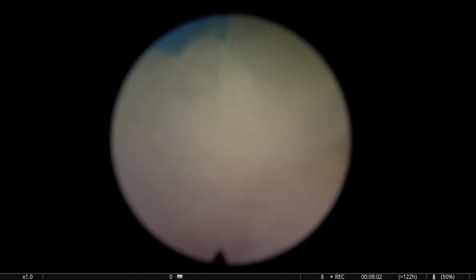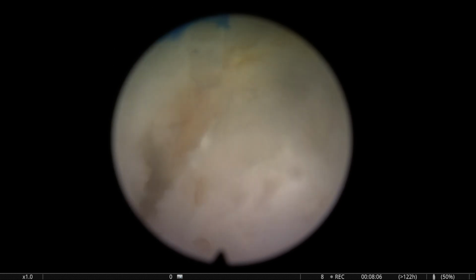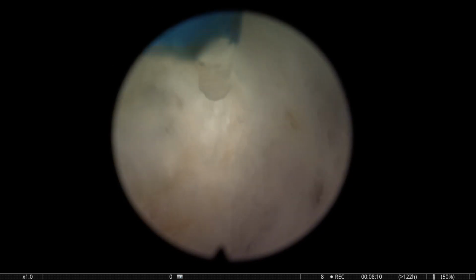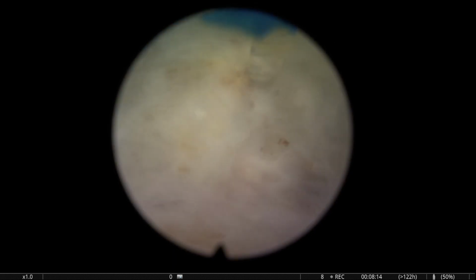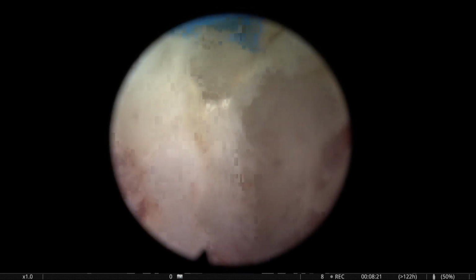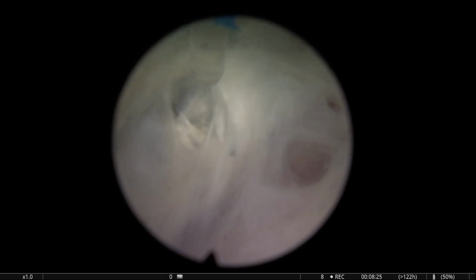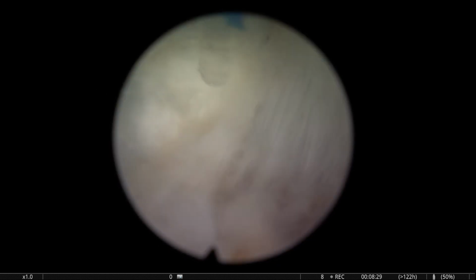But you see, there's more tissue there. There you can see there's a nodule. So it was a little bit tricky. Of course, these prostates have already undergone surgery and probably some more inflammation. Sometimes planes are not so friendly, and the only way you can defend yourself is to try to investigate if the depth is enough or not.